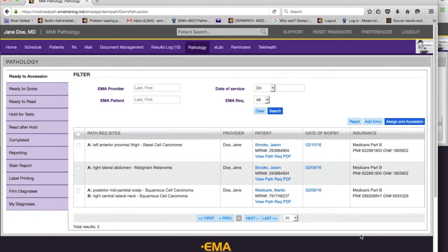Let me get into the pathology module. Here they are in 'ready to accession.' On the left-hand side you have the workflow: accessioning, grossing, reading, hold for additional stains, hold for tests, and read after hold — which is where you read slides if they were held for stains or sent for a second opinion or peer review.